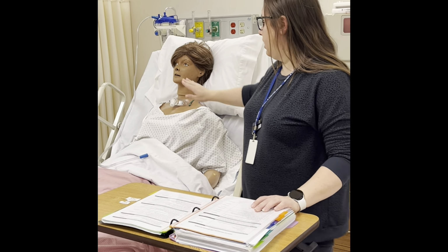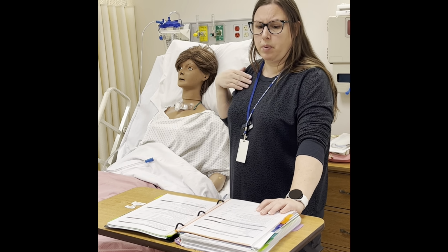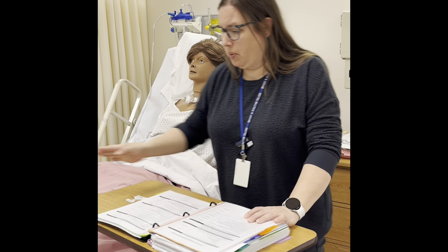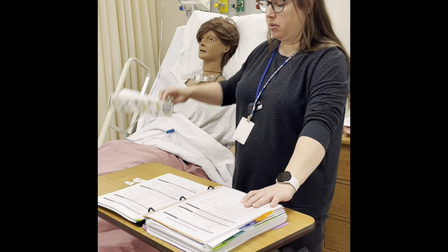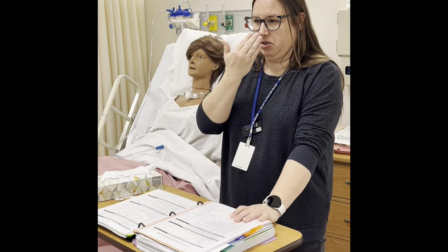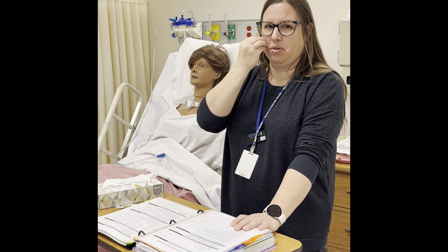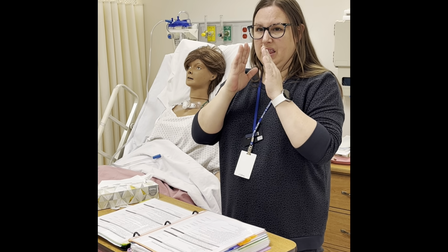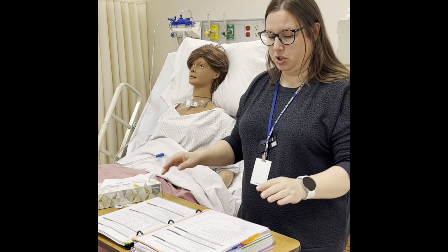We always want to stay on the same side of insertion. So we're going to be putting it on one side, and we want to stand on that side. Offer them to blow their nose. That's why the tissues are over here. Again, if you have stuff in your sinuses, the last thing you want to do is have anybody take any of that mucus and put it through the tube. Plus, if there's stuff in there, they still feel congested. It's really hard for them to blow their nose once the tube is in there.